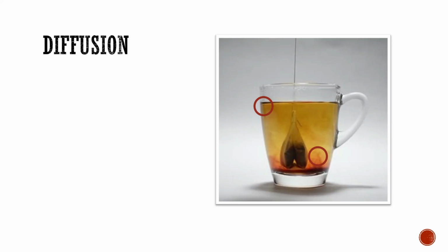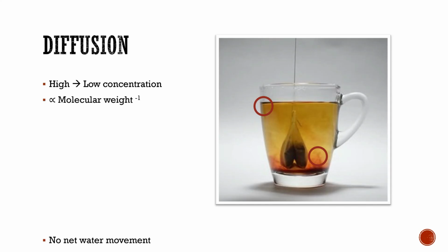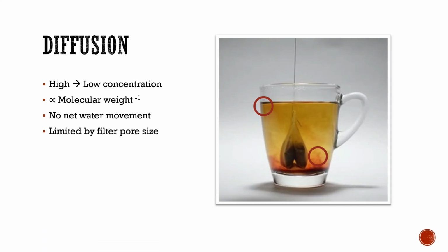That's exactly what happens in diffusion during dialysis. Solutes move from a higher concentration to a lower concentration, and the solute movement is limited by the pore size of the dialyzer membrane, just like the mesh of the tea bag.